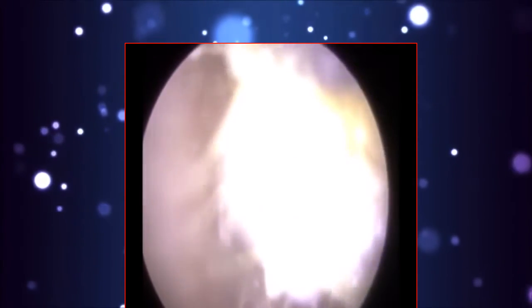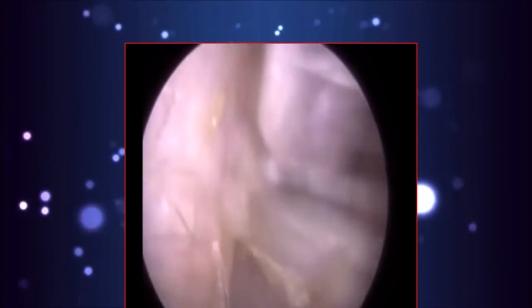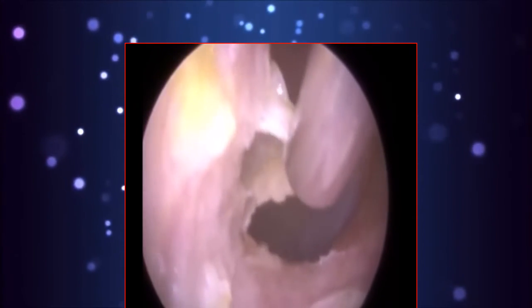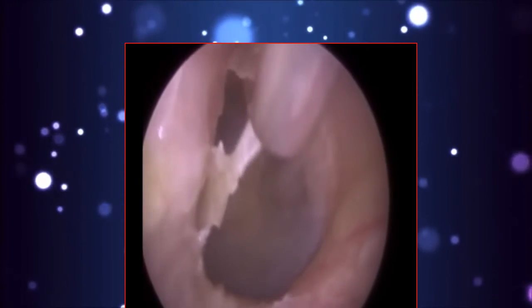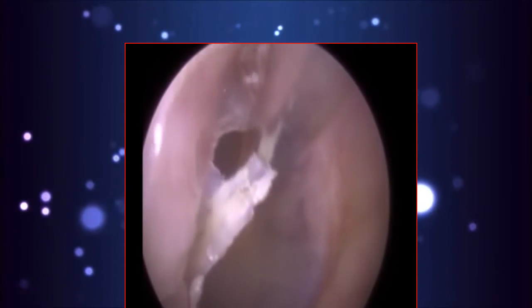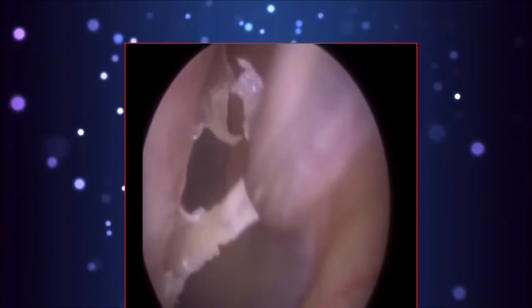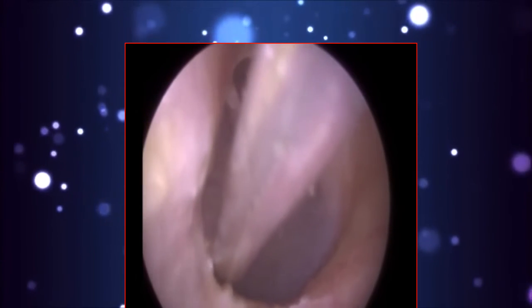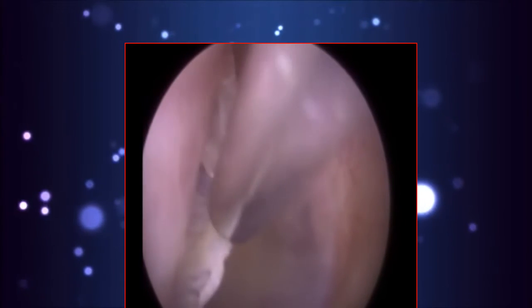So just using a fine end gauge to stop it clarineting. Again, I mean, we could have just left the procedure like this, but I just wanted to remove this dead skin, because this part of the dead skin anyway is ready to be peeled. But as we go towards the eardrum, this skin was a lot more stubborn, and there's a bit of a tug of war. I did ask the patient whether he was okay, whether it was uncomfortable. He said it was fine. There was no clarinetting because I used a fine end, so the patient was really unaware what I was trying to do in the ear. He didn't feel anything at all, but there's a bit of dead skin that we left behind despite my best efforts again.